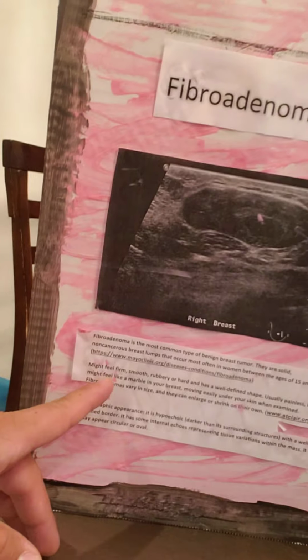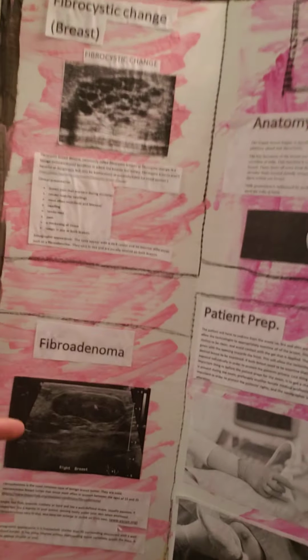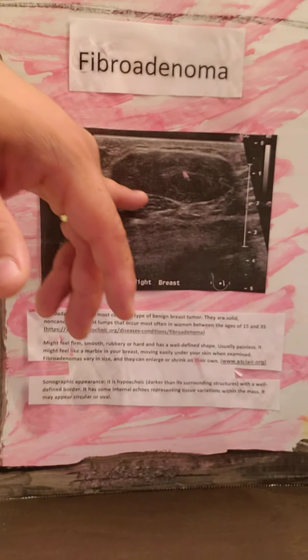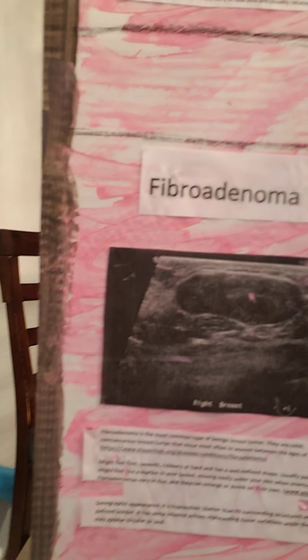As you can see here, it says it might feel firm, smooth, rubbery. Basically, when you palpate or when you touch the breast, you feel like a bump, and it slides up and down. That's part of fibroadenoma. The sonographic appearance of it, when we're scanning and we notice it, as you can see, it's dark, and it has smooth edges all around it, which makes it a tumor. And it having smooth edges makes it appear that it's not malignant, it's not spreading like cancer.